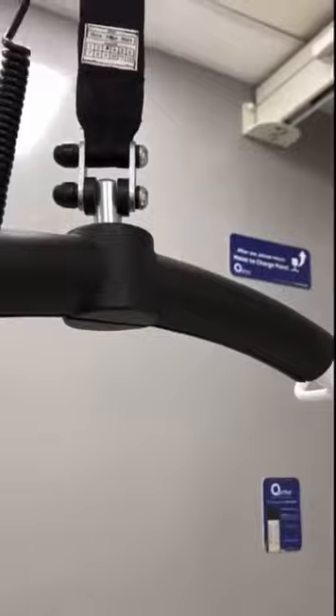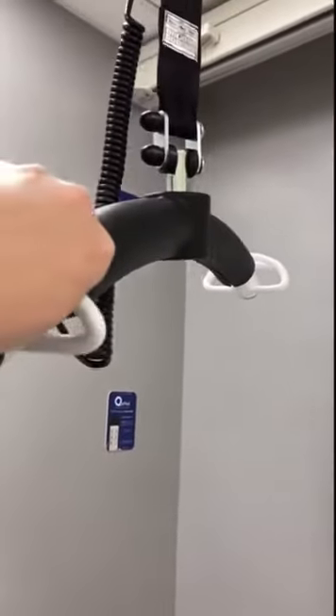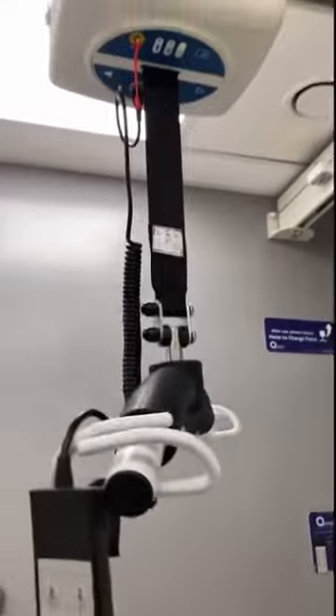The hoist will go to the floor if required. However, if somebody has fallen and is injured, please do not use the hoist. Please adopt standard moving and handling protocols, for example using the hover jack.